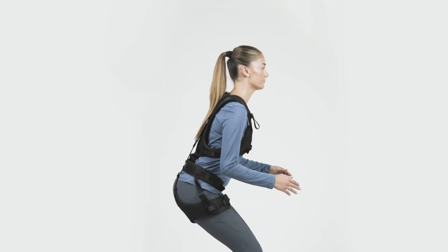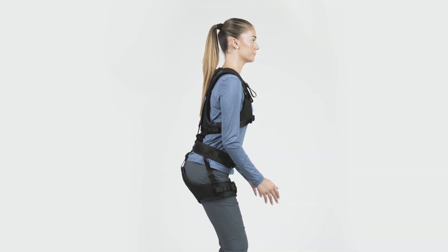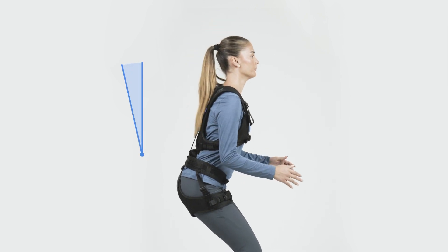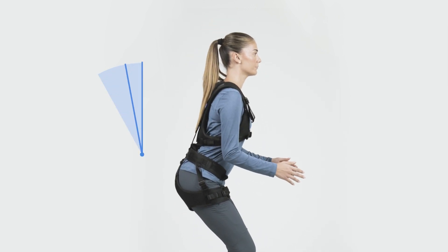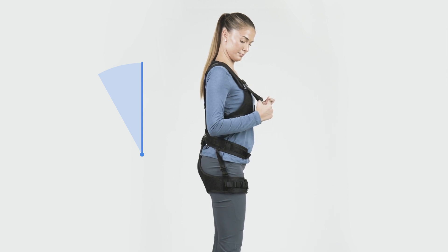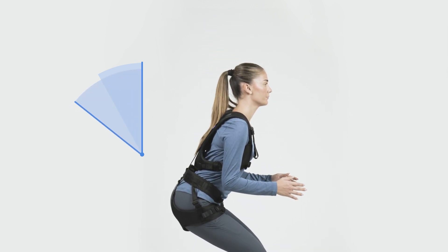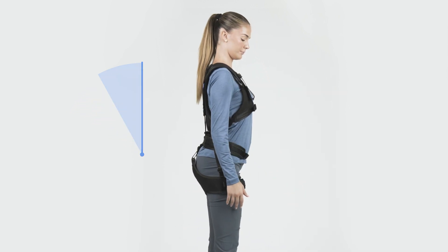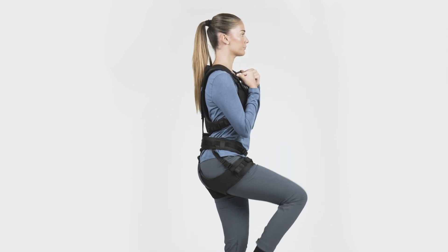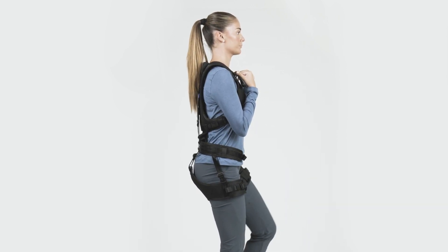Familiarize yourself with the support by leaning forward or reaching downwards. To find a suitable level of back support, first pull the activation loops down only two centimeters. Then gradually increase the support by pulling the loops more and more downwards until the support suits your work task. It is advised to deactivate the back support when walking around or doing work that is not straining for the back.